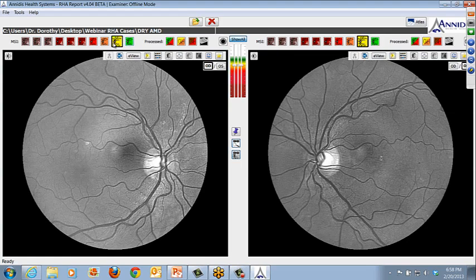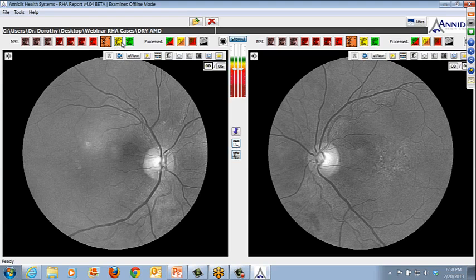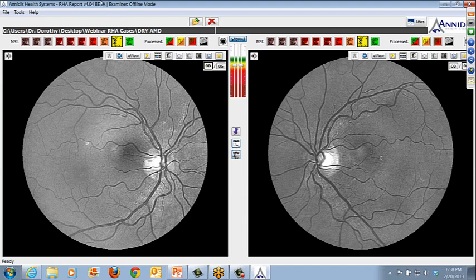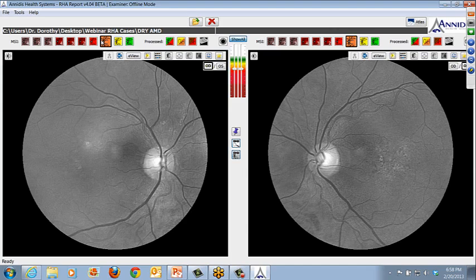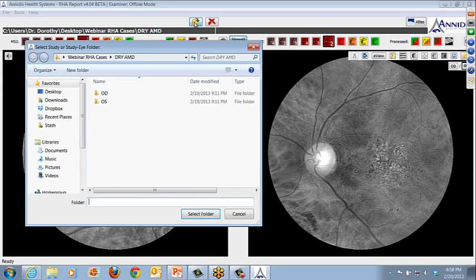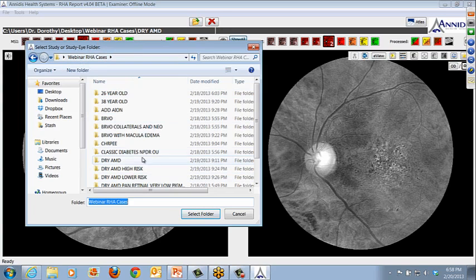Now I'm going to show you how to toggle back and forth and look for drusen. In this particular case, there's a relative lack of drusen. There might be a couple of places here on the yellow and the, excuse me, amber that show small patchy areas of drusen. And remember, it's the combination of RPE dysplasia and drusen that puts a patient at highest risk. But even a patient with this level of atrophy, which I consider to be significant, you can employ some treatments. Okay. Are there any questions about this type of patient presentation? I'm going to move on to some other cases.